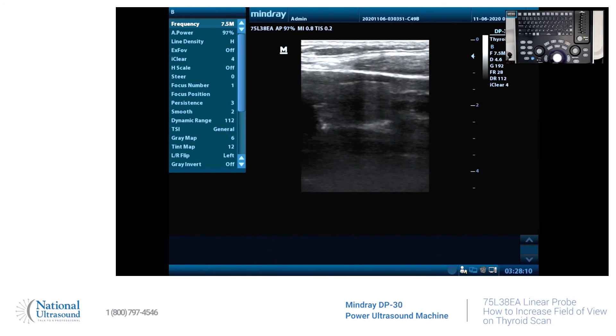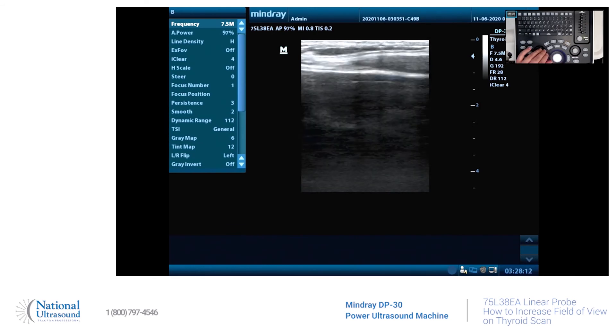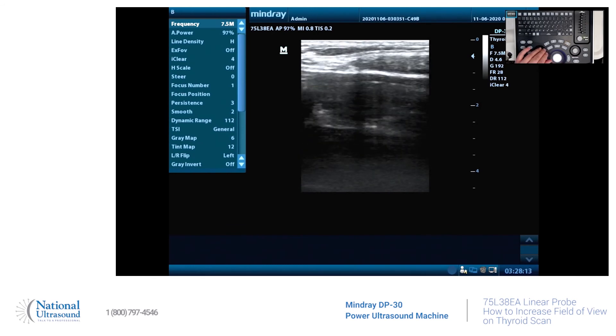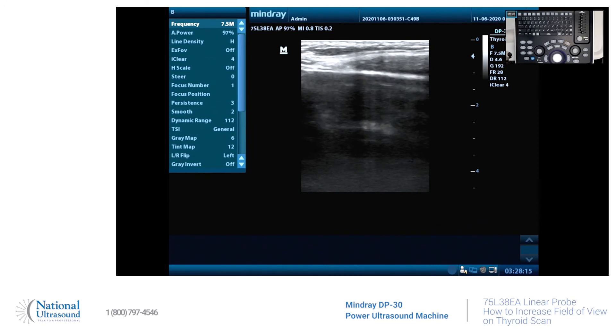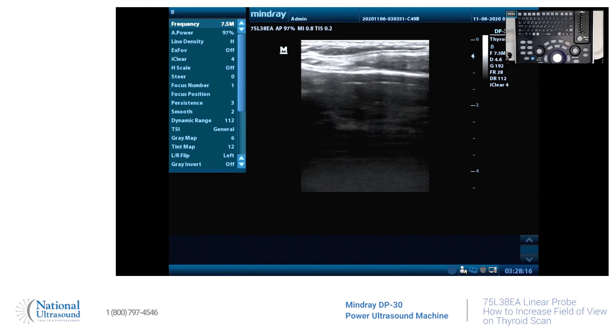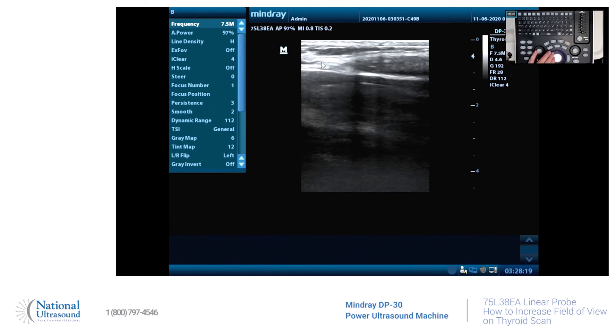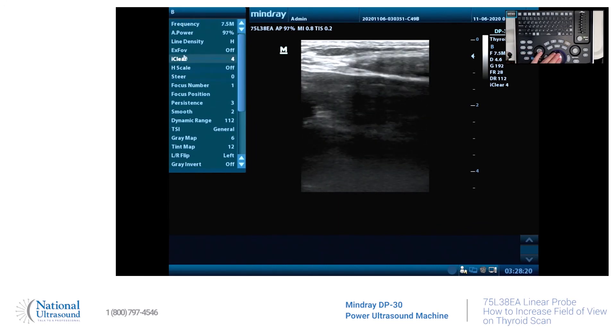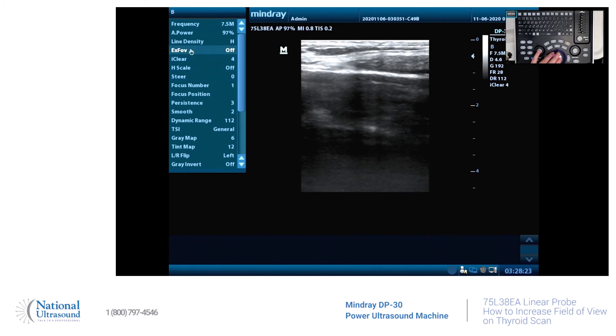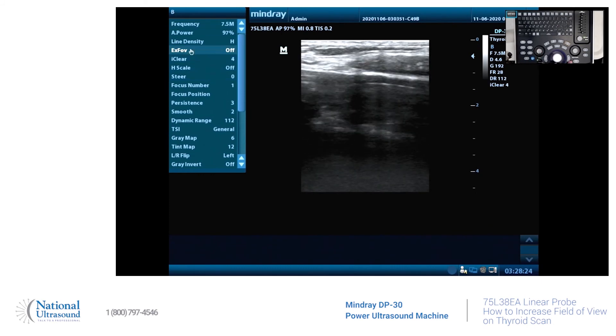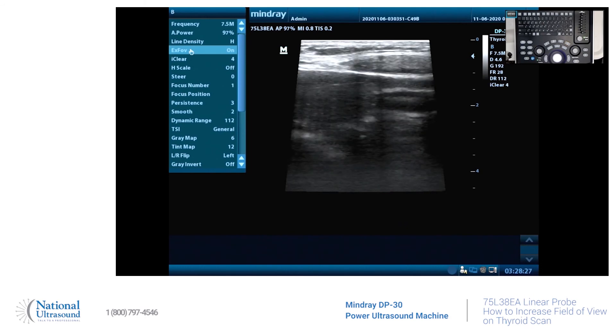There's my thyroid. Let's just pretend that it's enlarged and you need to increase the field of view. So you hit your cursor button, you go to increase expand field of view, turn that on. There we go, and it is expanded.